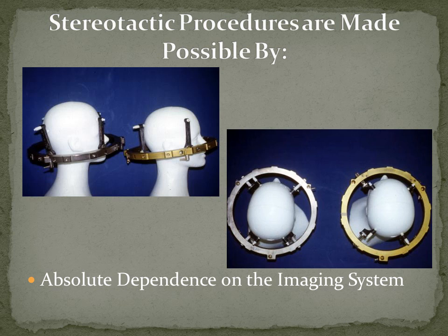The head ring essentially does two things. One is it holds the patient's head rigid for imaging and for treatment. People always comment after you put the head ring on. I've done 3,000 to 4,000 of these, and probably half the patients comment, "Boy, this is really tight. I'm not moving, am I?" And that's the object of the entire exercise: to immobilize them relative to the reference. It doesn't really matter where they are in the reference. All that matters is that this reference, once attached and the procedure starts, stays rigid.